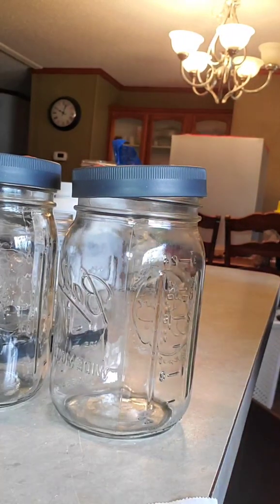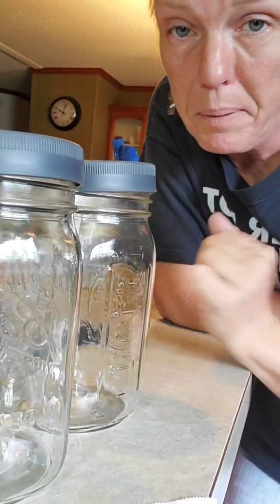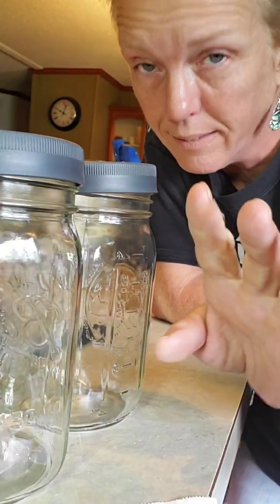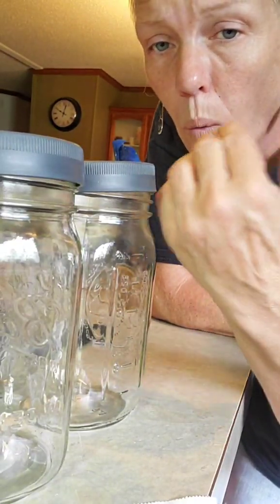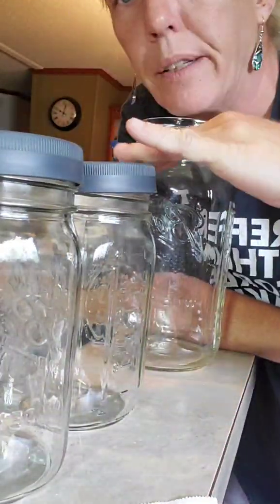If you guys saw my glassware, you would be laughing right now. I am doubling this recipe. There will be 500 milliliters of water in each of these jars, but we're not mixing in each of these individual jars. I will make one recipe with my big jar. Everything gets mixed in here, and then it gets poured into these. They get covered. They get put in the pressure cooker.